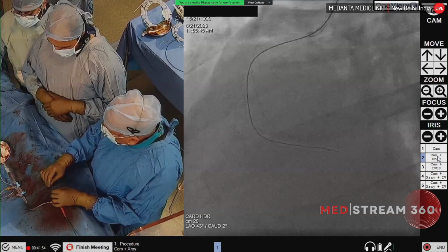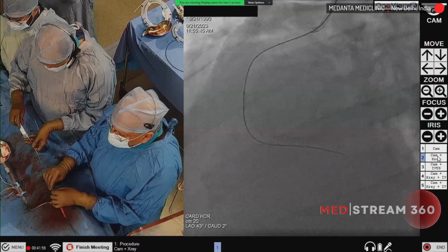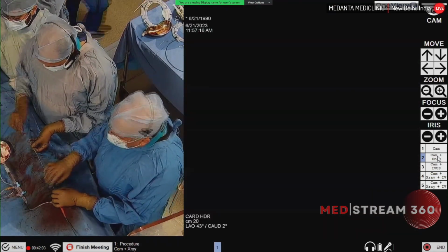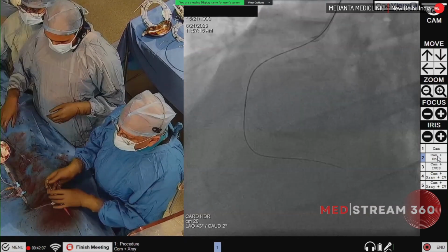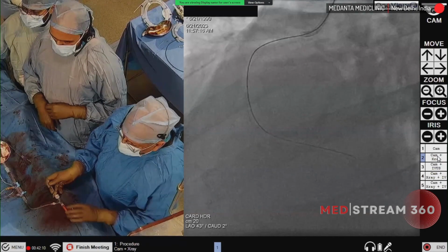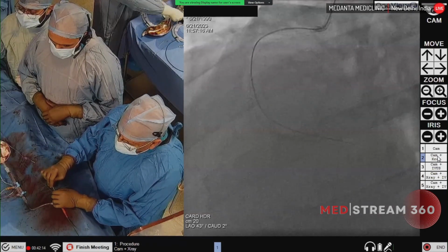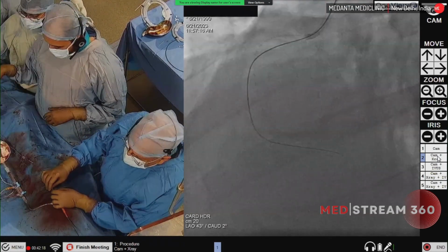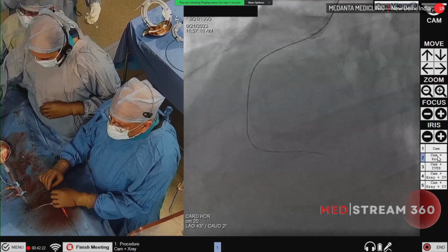Okay, we can connect now. Go up, please. 1, 2, 3, 4, 5, 6, 7, 8, 9, 10.